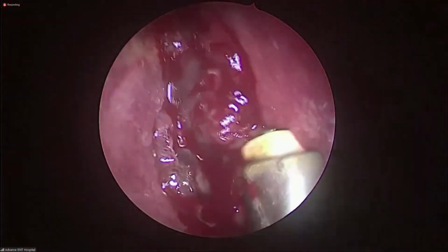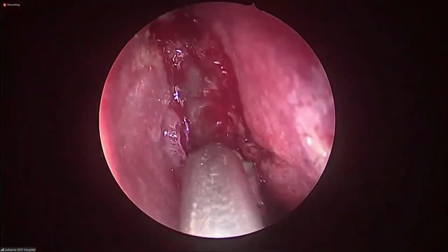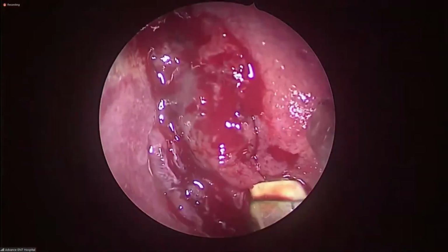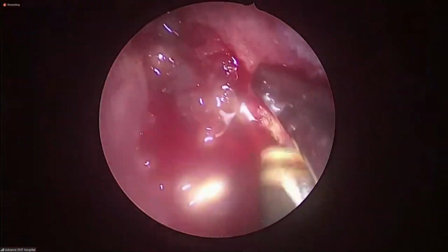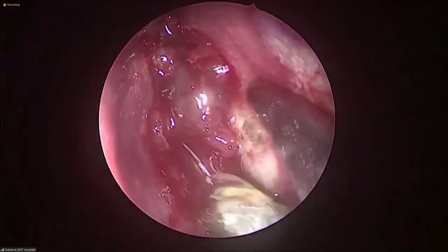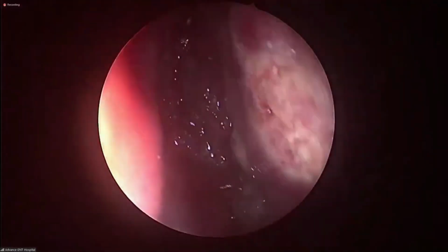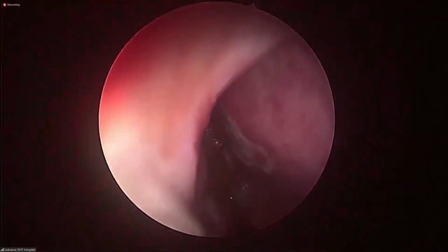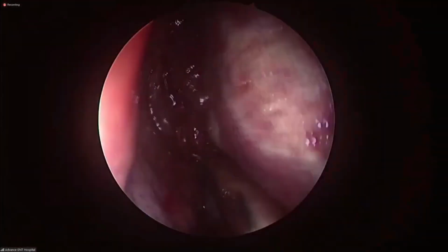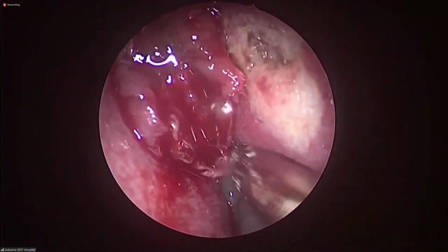See, we have to manage bleeding all the time. There is no answer to it. Yes, sir. See, the high deviation is corrected on this side. See this? Yes, sir. Very clear. Earlier there was no space to enter into. Yes, it's good now.